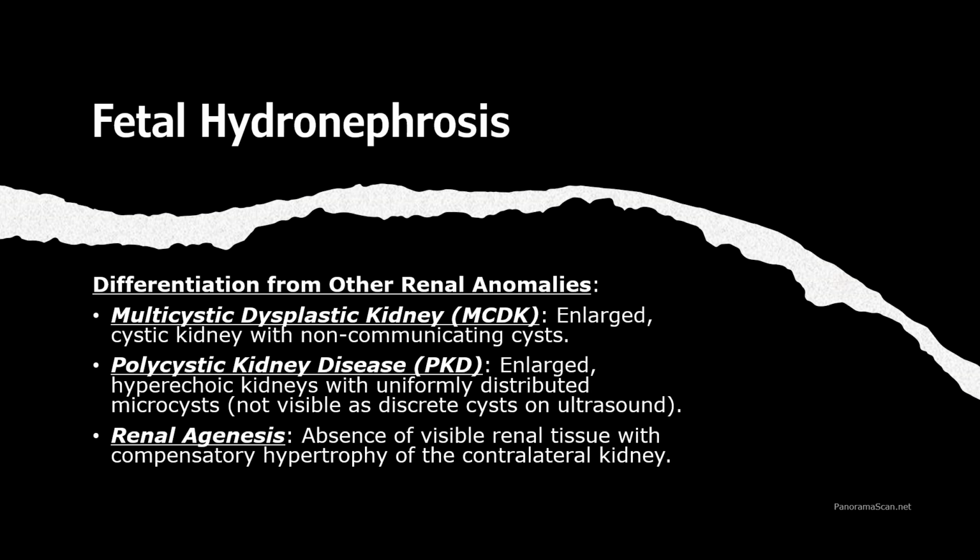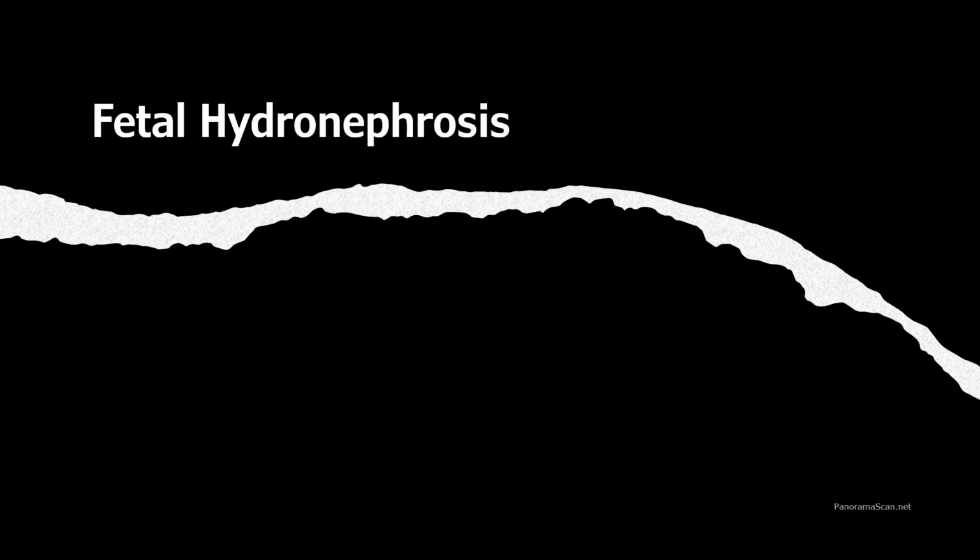By distinguishing these conditions, you can be better prepared to identify the correct diagnosis and manage the care accordingly. Understanding these differences is critical for accurate prenatal counseling and planning. In this slide, we will discuss the management strategies and prognosis for fetal hydronephrosis.